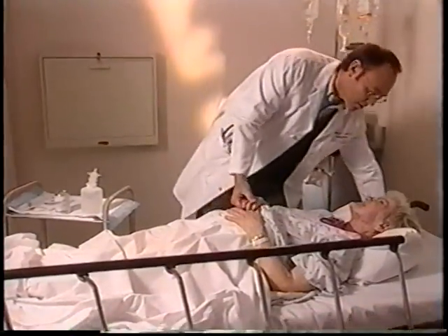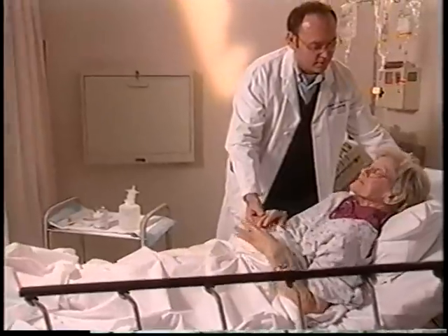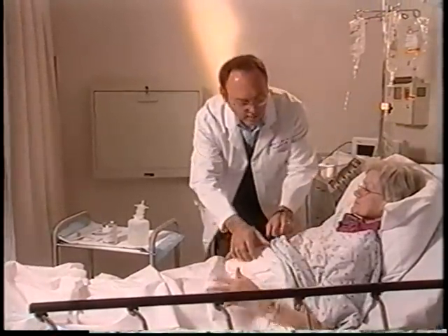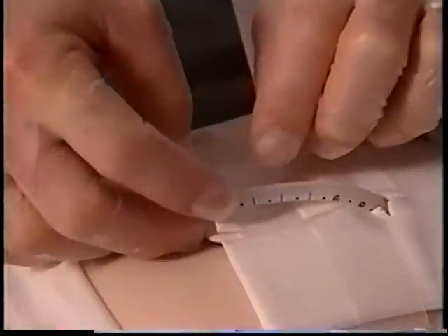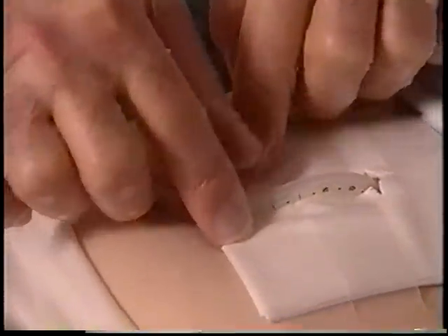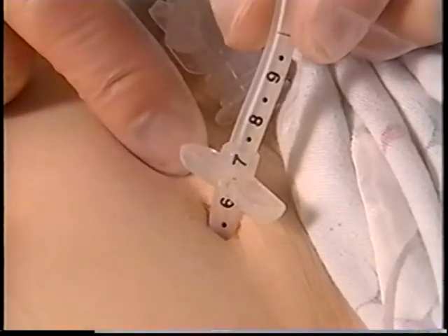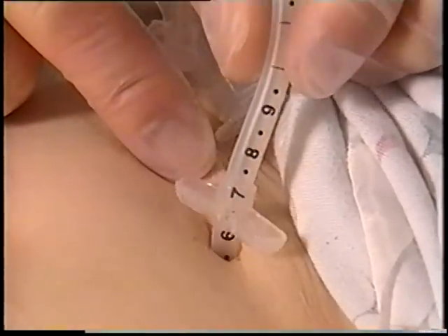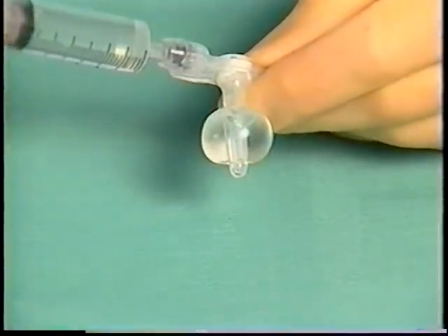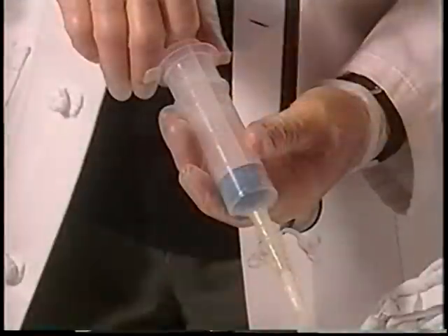Leakage around the tube or button can occur. This may be due to improper patient positioning during feeding. Keeping the patient upright during and after the feeding may resolve this problem. Leakage around the tube may also result if the tract enlarges. This may be prevented by proper stabilization of the tube without tension. If the patient gains weight, the external bolster may need to be repositioned. If the tube has a balloon, increasing the amount of water in the balloon may also help stop leakage.